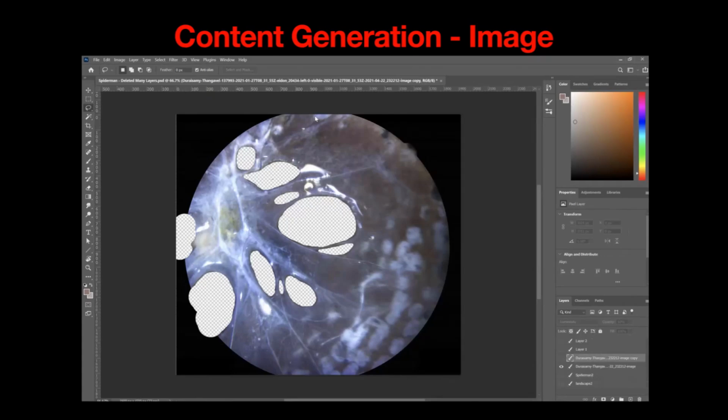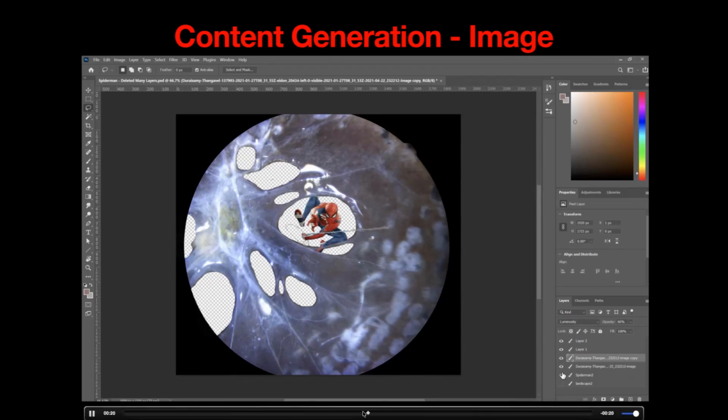Again, this is a tractional retinal detachment where you can see I've made a few holes in it voluntarily. And what did I do for that particular event, which I pitched at the ASCRS OPS event, where you can see genuinely I've made a few openings here. Let's see how this image comes out. This is again one of my images in the after effects category, where you can see I'm pitching Spider-Man inside.